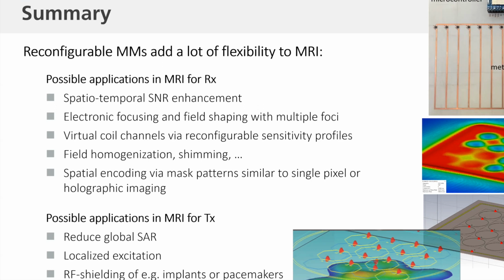So while the audience is quiet, on the big picture, why do we want to have gradient-free spatial resolution? Okay, we save building gradients, but do you think there are advantages? It can be better?